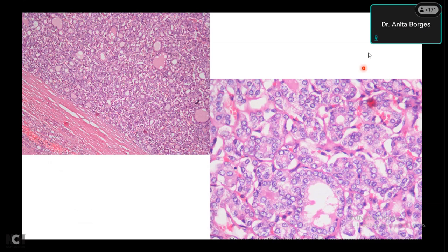Okay, you have a non-invasive follicular tumor with papillary thyroid nuclei, which is NIFTP. Why don't we call this lesion an invasive follicular tumor with papillary thyroid nuclei? But we don't call it that. Right. Now we are calling it invasive follicular variant of papillary thyroid carcinoma. So that lesion, which Asaveri has just shown, is a rare occurrence, and it's not going to behave like the standard diffuse follicular variant of papillary thyroid carcinoma.